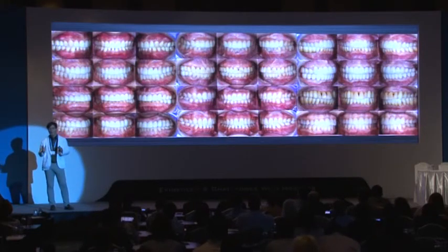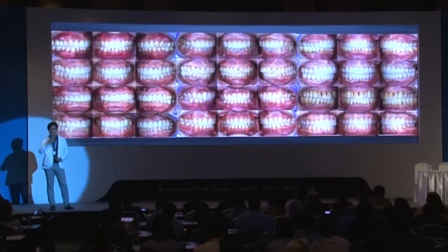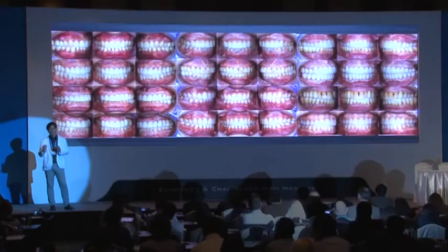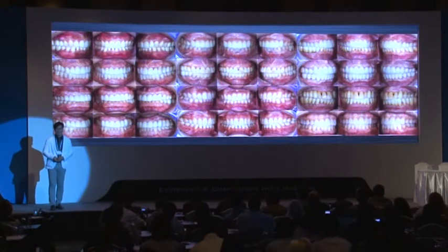We also have to see the very big, huge images. It means the patient's skeletal patterns. Even though we make very nice porcelain or prosthetics, if it is not in harmony with the facial patterns, it is meaningless.